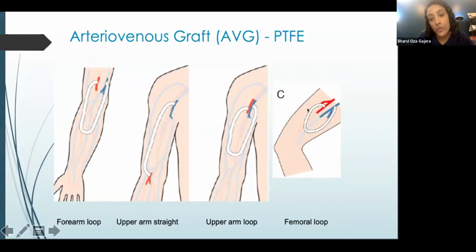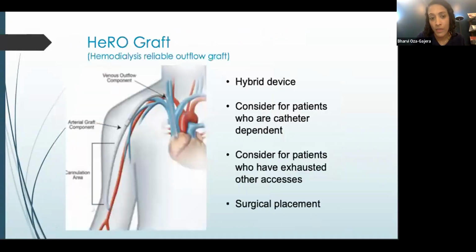And then a femoral loop graft is a last resort access that can be placed in patients who need them, but luckily we don't see them quite as much, at least in this area.